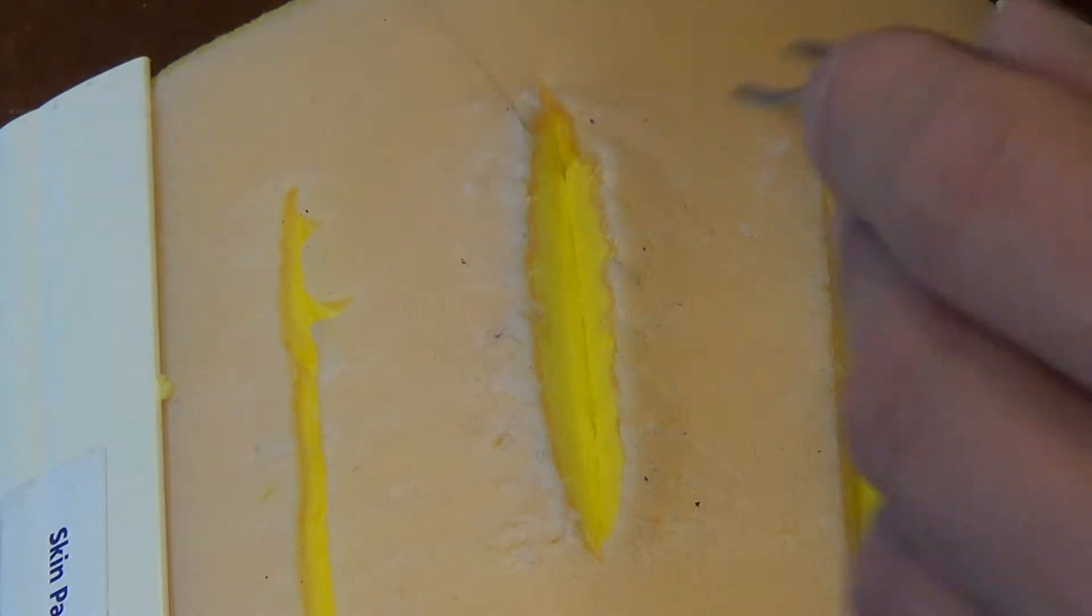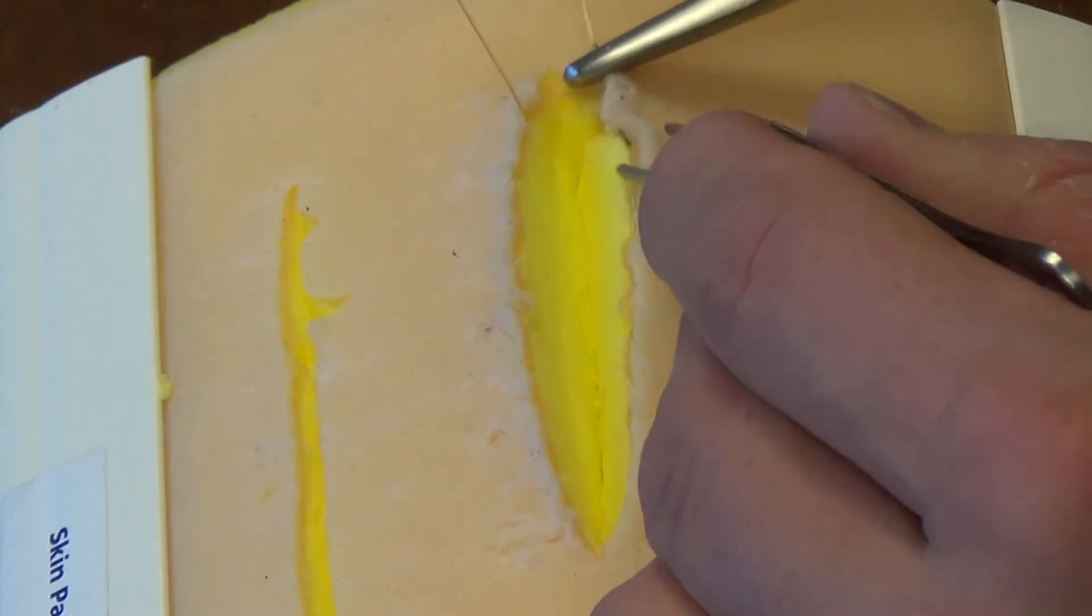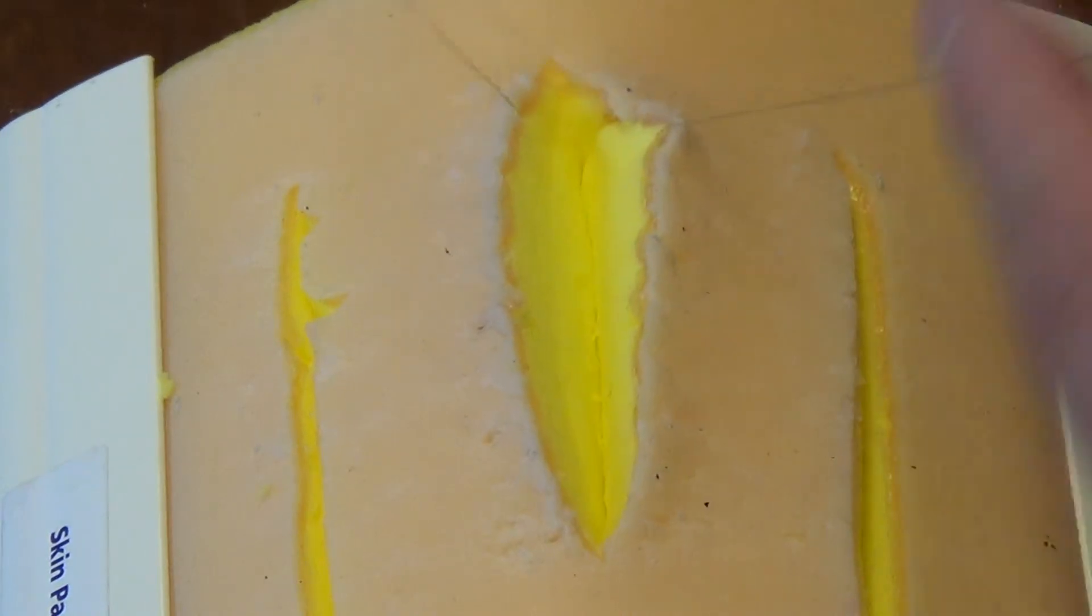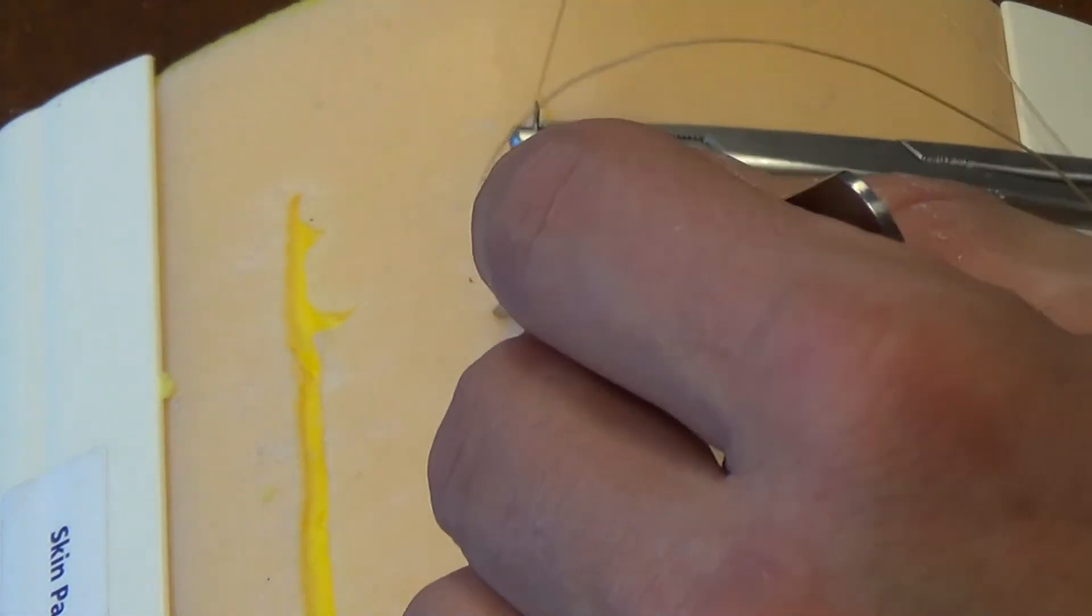I'm going to cross at the same level. This is just traditional subcuticular deployment down the tissue line.